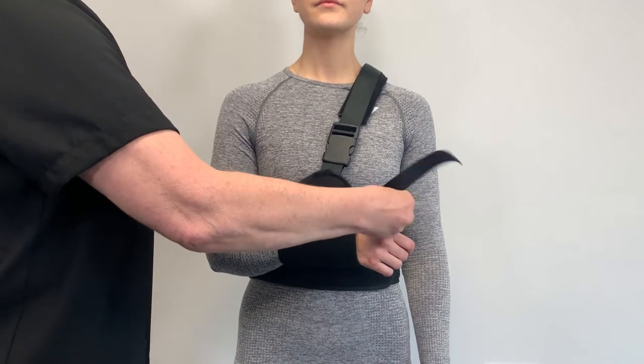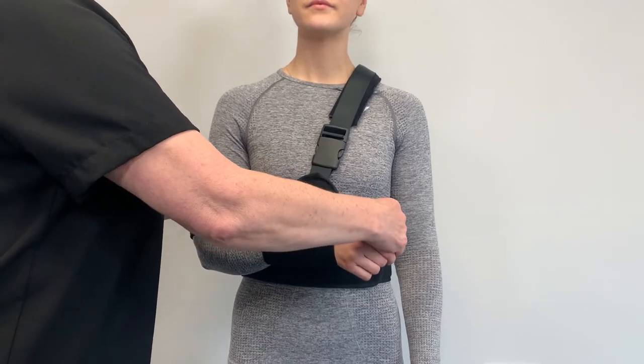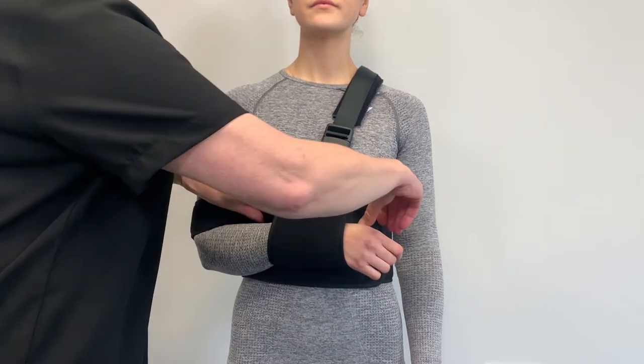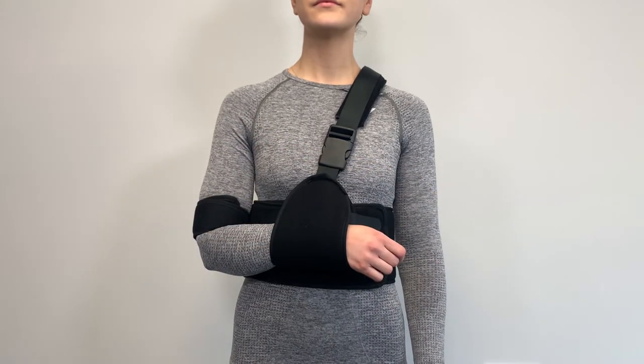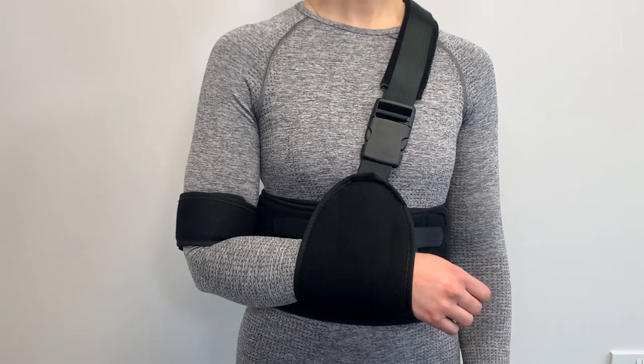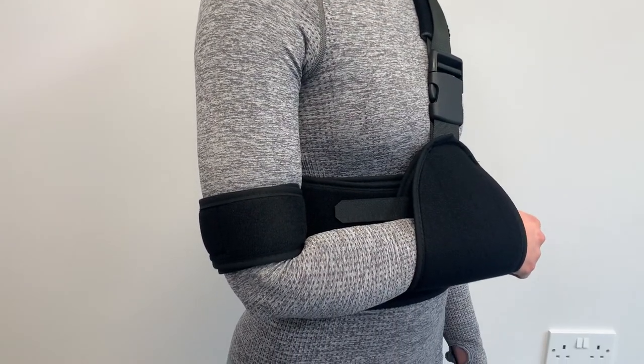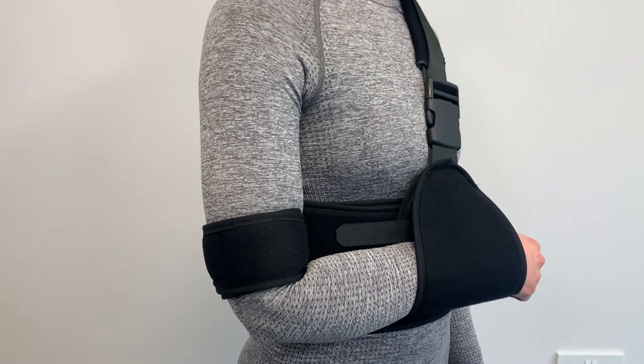Secure the wrist cuff to the swathe with the hook strip provided. When minor adjustments are needed, for example repositioning the shoulder pad for greater comfort, the shoulder strap should be used to support the affected arm throughout the procedure.